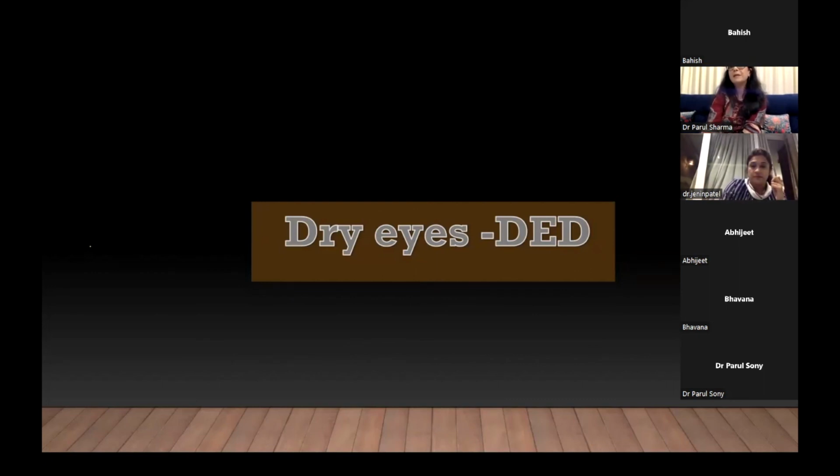No, tell me, but that's my Jenin, post myopic LASIK. So post myopic LASIK, you want to use an aspheric IOL. Whether you want to use an aspheric IOL of minus 0.17 or minus 0.27 will be decided on your spherical aberration value. Okay. If you are doing a hyperopic LASIK, those patients are already going to have their spherical aberration in the negative value. So putting in an aspheric lens for that patient is going to make him more aspheric. So you want to do a traditional IOL with a non-aspheric IOL for this patient. So a spherical lens with a positive, the ones that we have routinely with no asphericity.